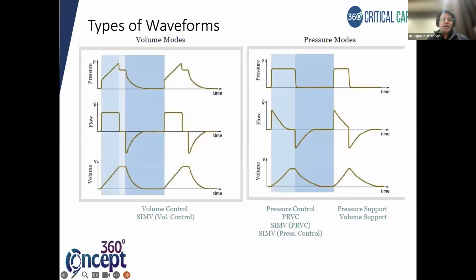Clear? Now, if we are trying to differentiate between the volume mode and the pressure mode, I asked you the question 2 slides before. In the volume mode, you will get the pressure scalar like this, flow scalar like this, and the volume scalar like this. This is volume control. In the examination, they will try to confuse you. So you have to be very sure.